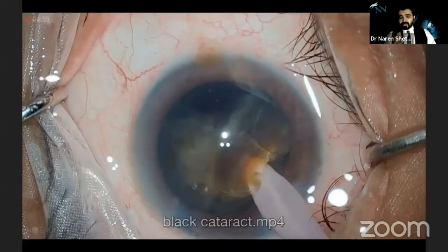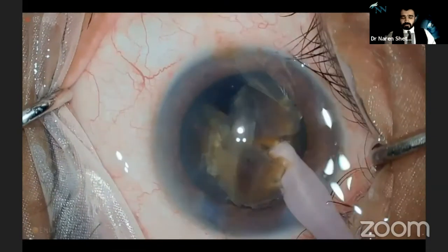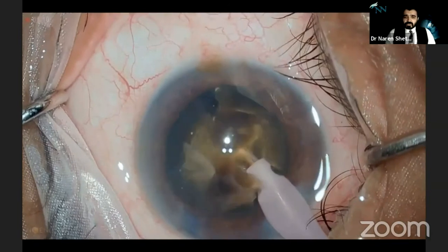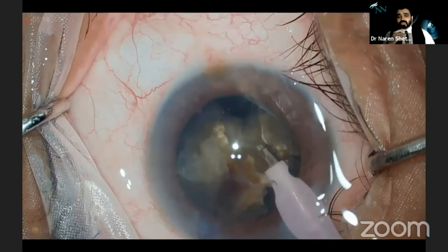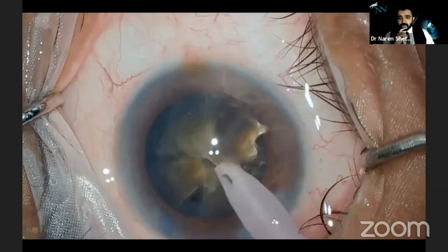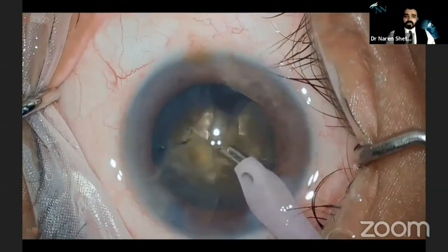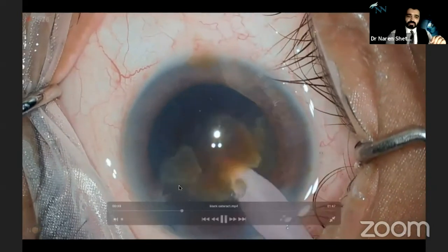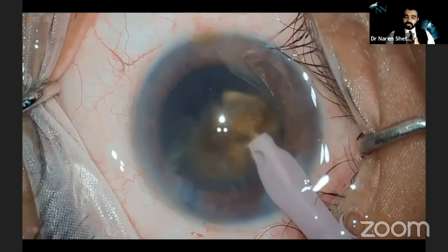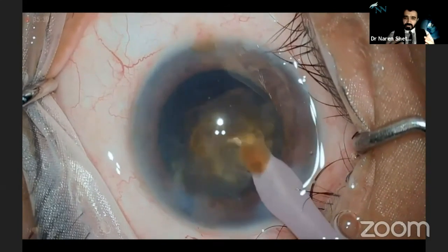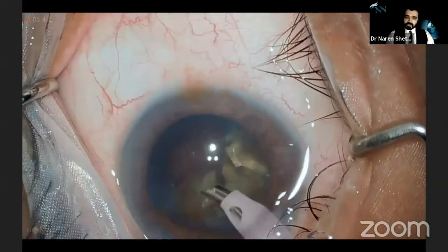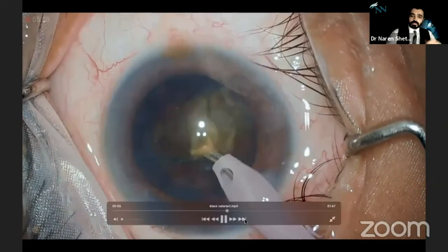I hold the posterior capsule and release it without any complication — this is only possible with no lag. If there was lag, there would be a PCR. Even with a black cataract, the Centurion system simply melts the nucleus in front of the tip, resembling an NS2 grade. I use a single-handed phaco technique, finishing all chopping first, then emulsifying. With no sideport leak, there is only one inlet and one outlet, making fluidics within the anterior chamber much more controlled and pieces come more naturally to the tip.